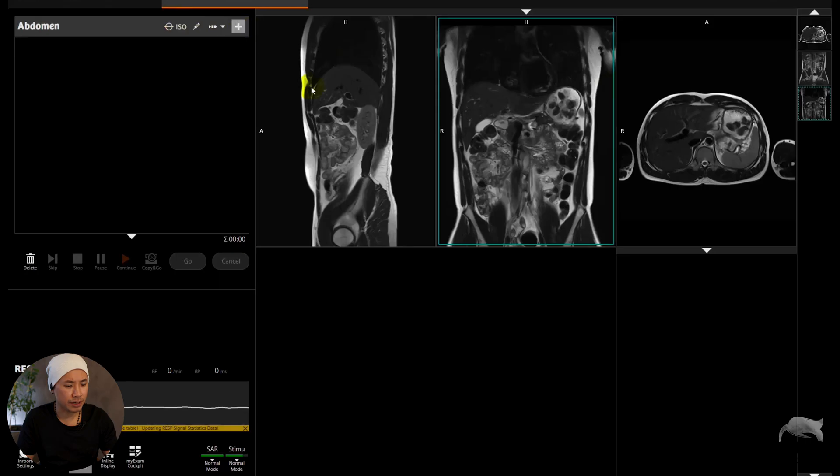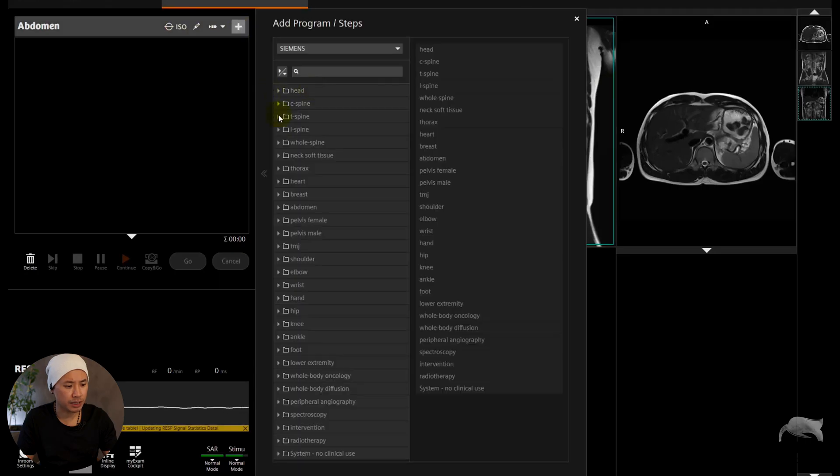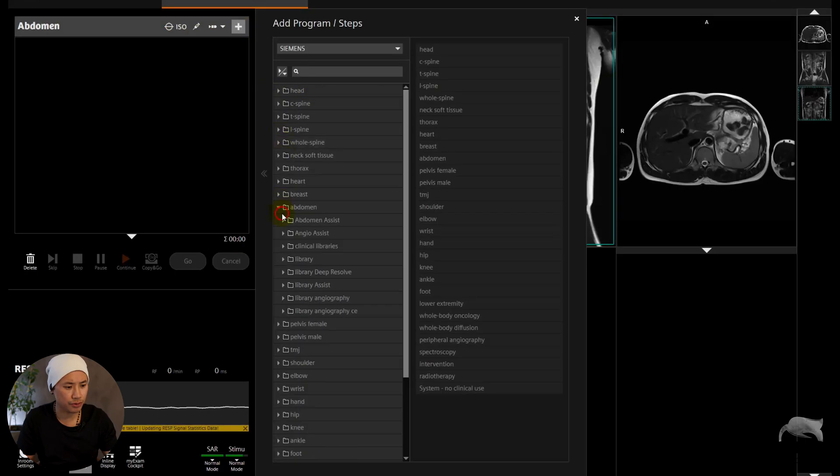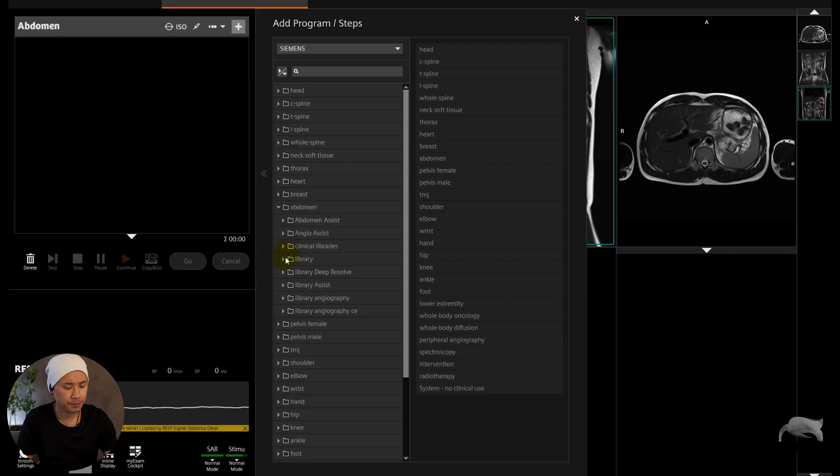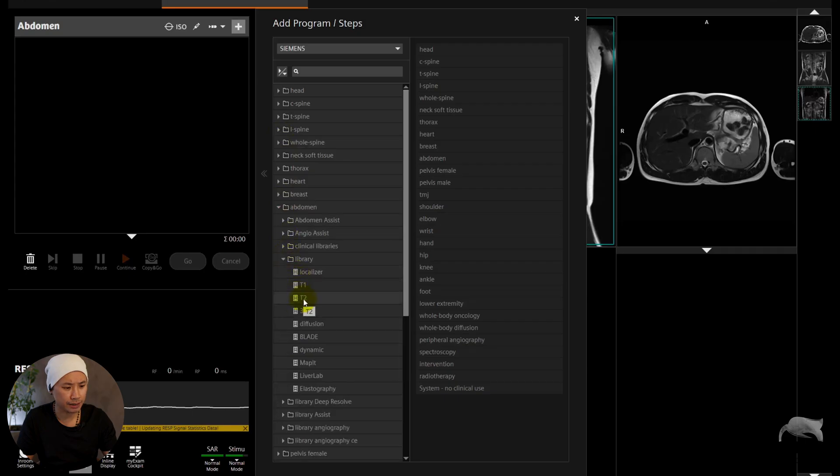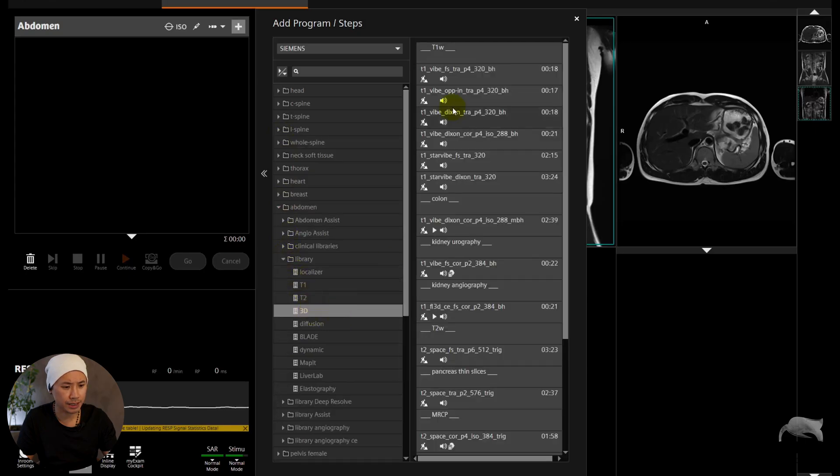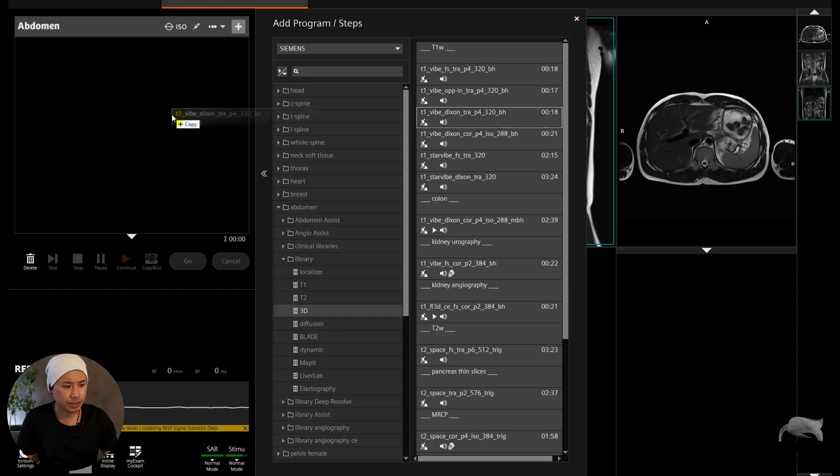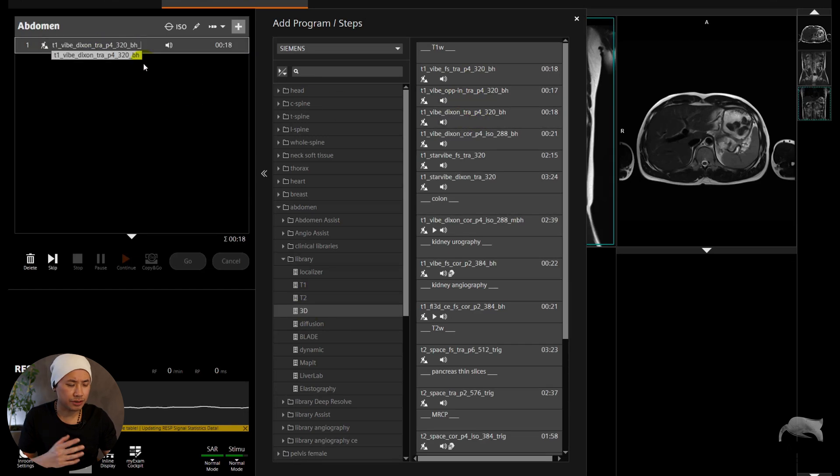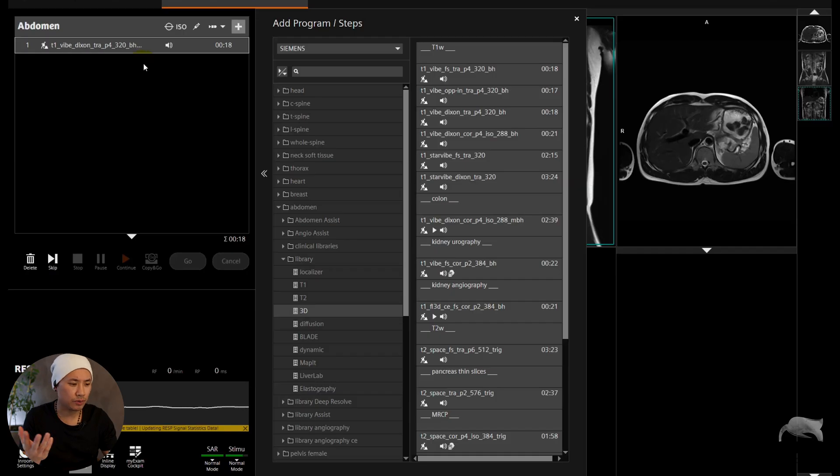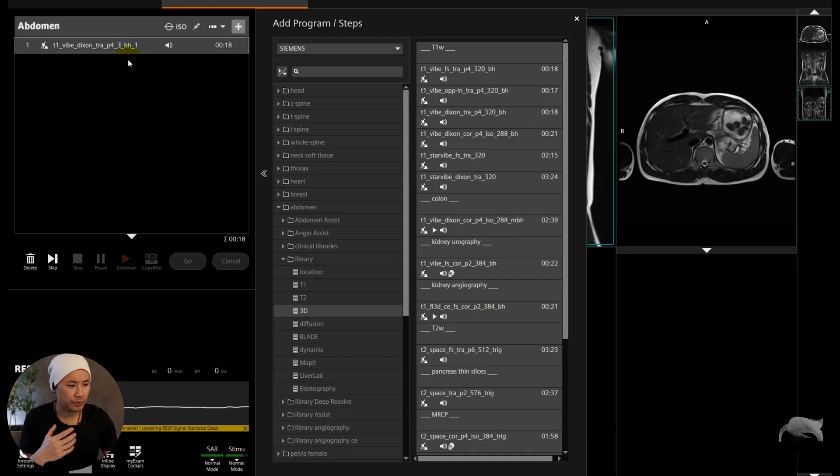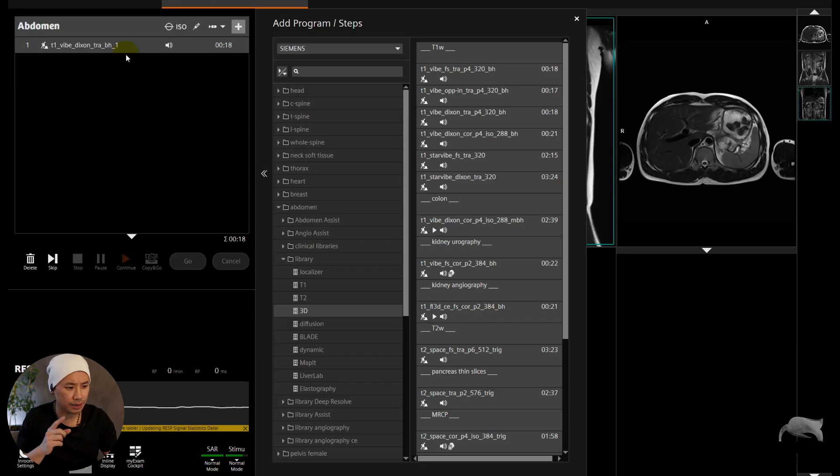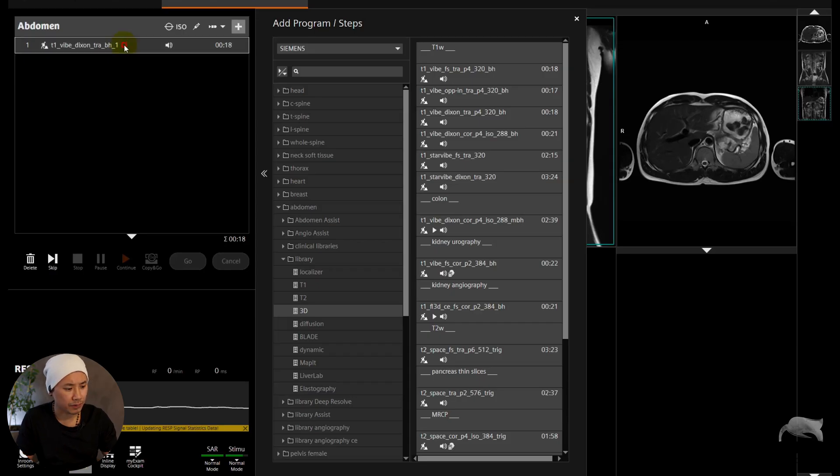I will show you now. Let's go to the Siemens tree and we will pick up one simple sequence, VIBE Dixon, just to show you. We find it right here and it's a 3D, so let's just choose this one. We open this one and I'm gonna rename it. I'm just gonna rename to make it easier, just call it Step 1.